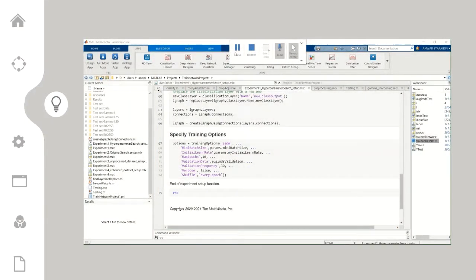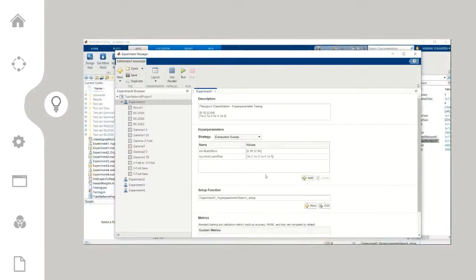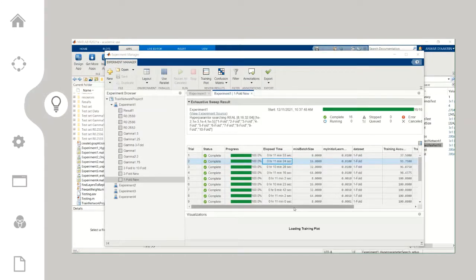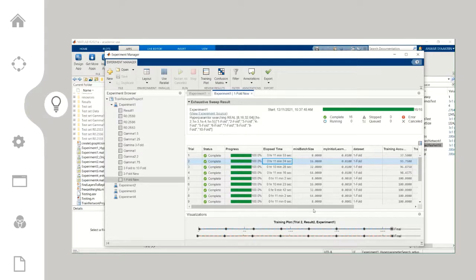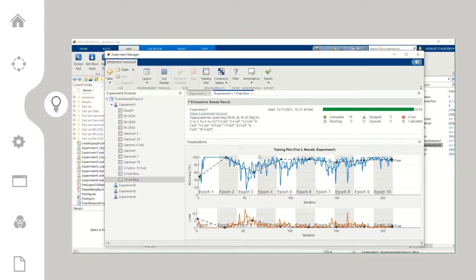Instead of training the deep learning models one by one, I will use the experiment manager from the MATLAB app to train all the models in abundance. Here, we can see the values of hyperparameters that I want to train on. Here, we can see all of the models have completed training, so we can view one of the models to see its training graph. By clicking the training plot, we can view its training graph. Here we will see the training graph of the model.